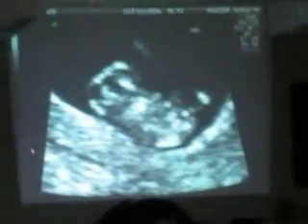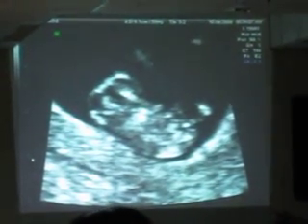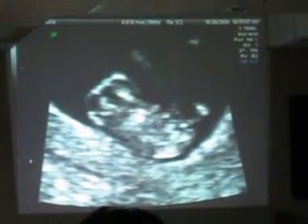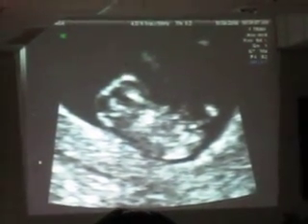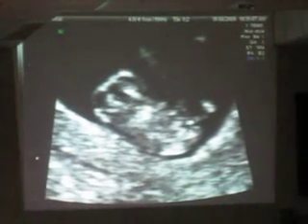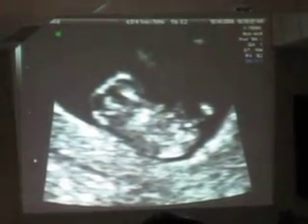Is there an entity called early growth delay? Yes, there is an entity called early growth delay, but proving that entity is the biggest nightmare. The rule in early pregnancy is if the CRL does not correspond to gestational age, then you change the dates.